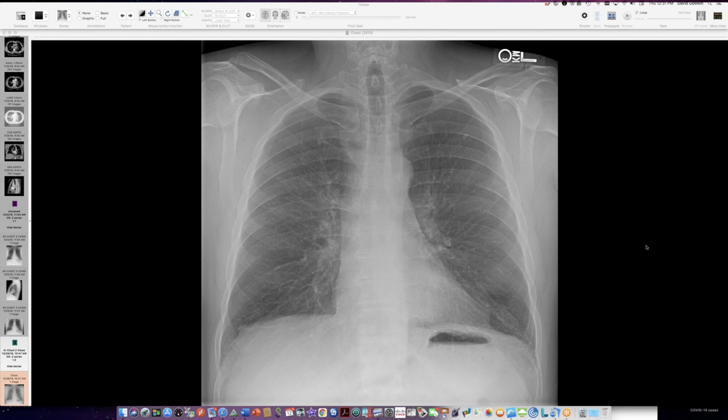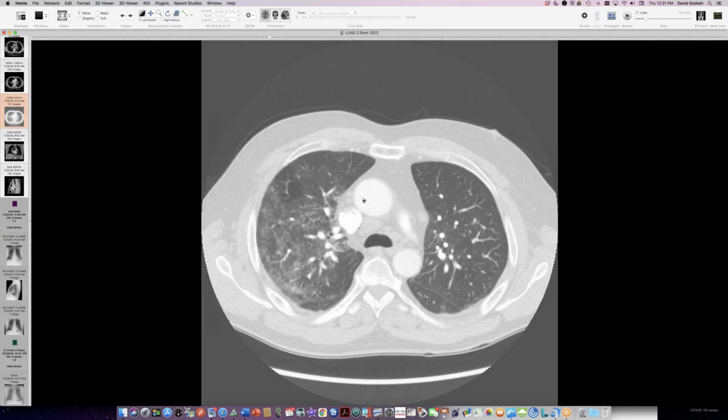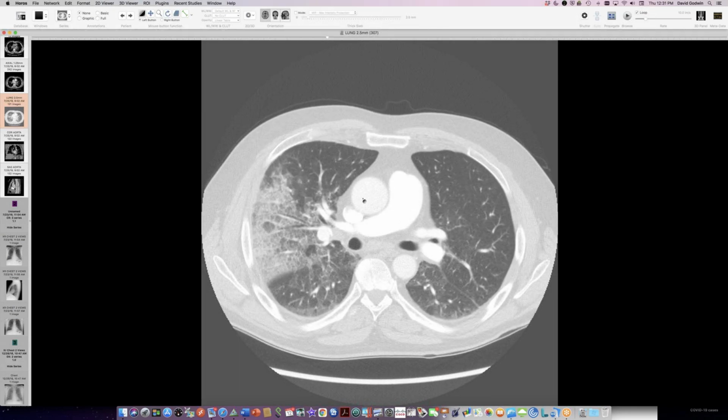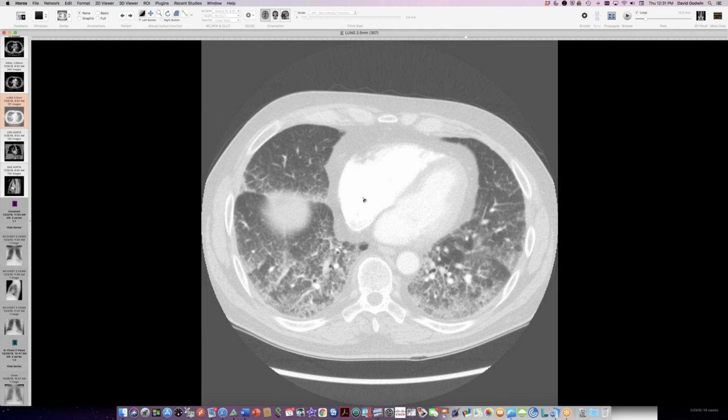So this man with Crohn's disease has a pretty normal chest radiograph at this point. Maybe a little atelectasis or scar on the bases, nothing too scary. Things did not stay that way. So this is a while later, and he now has some basal consolidation. It's a particularly big blob out here laterally, but it involves both bases below that as well. And then he had a CT scan, which shows consolidation here, mostly ground glassy in the right upper lung, extending down into both bases. So widespread ground glass abnormality.